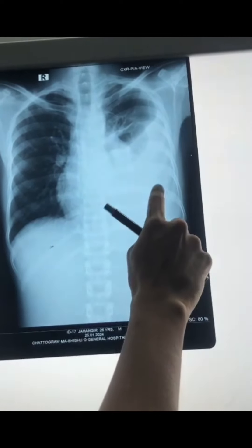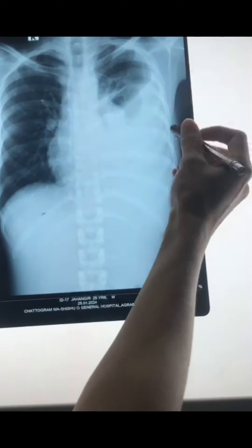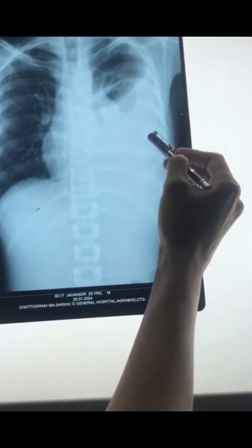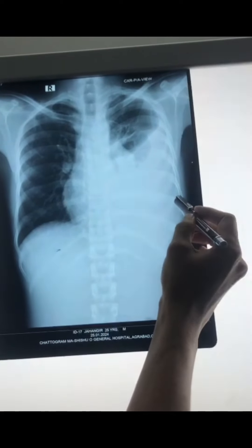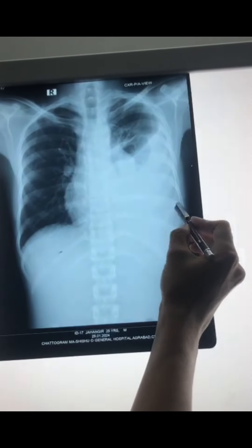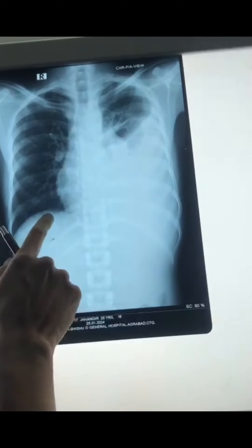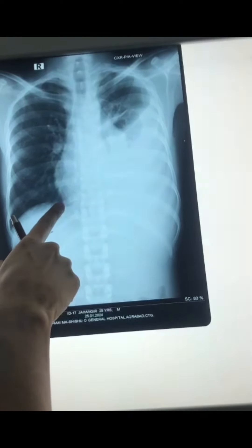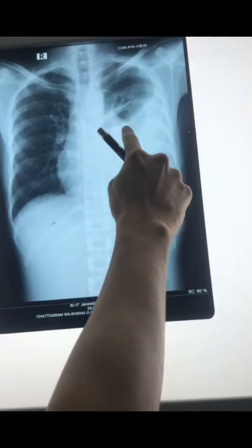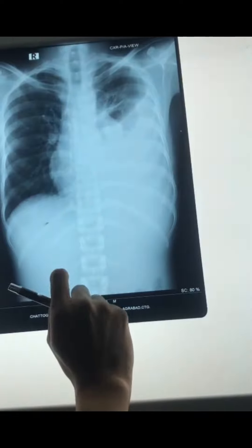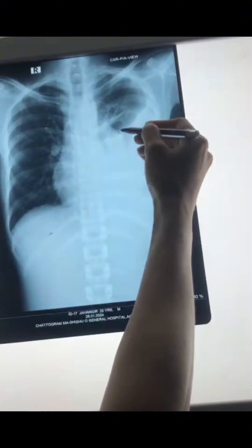What are the findings here? There is a radio-opaque, hyperdense shadow involving the middle and lower zone of the left lung. It obliterates the cardiophrenic and costophrenic angle. It also obliterates the left heart border. The important finding is that we can see an upper curvilinear margin.